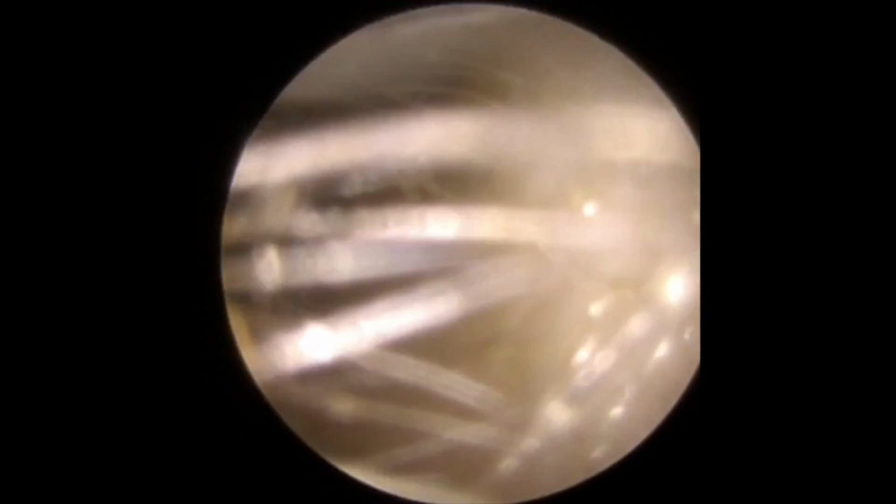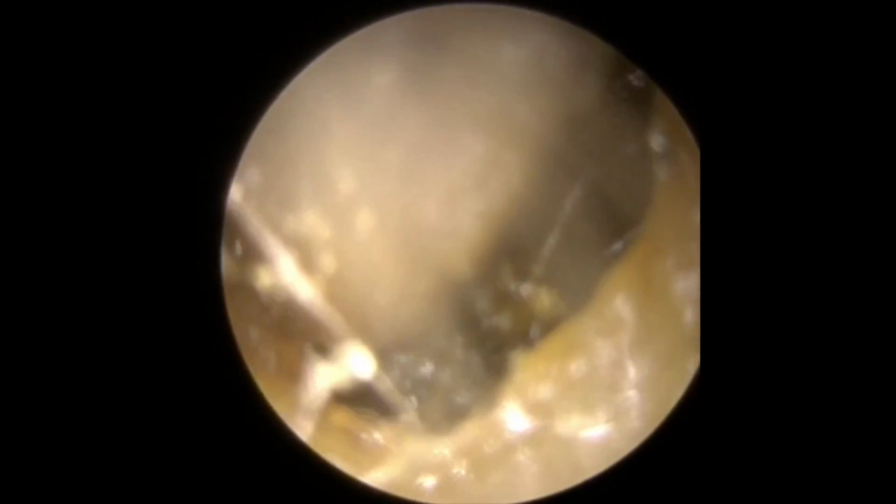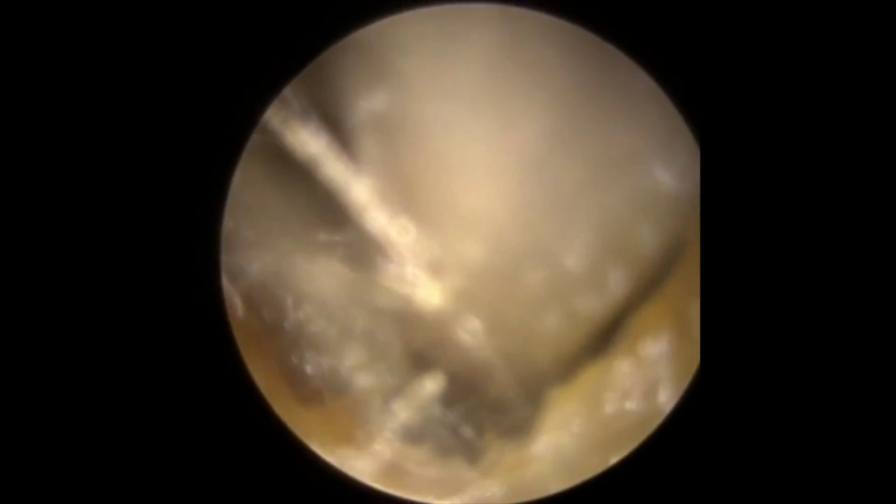We've got two patients in this compilation. So first patient's come through with very soft earwax, so lovely open ear canals here. Very sticky and soft wax. So we're just using the standard size Zollner tube, just going into the ear canal, lifting the wax from the base of the canal at the moment, so unsticking it from the canal walls, which is going to help us to remove it a bit later.